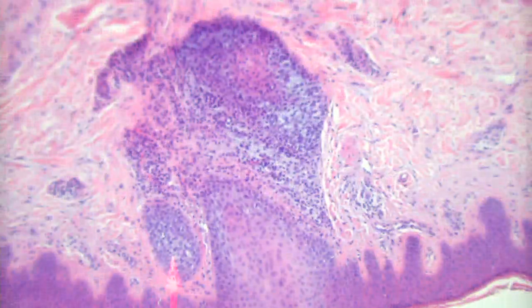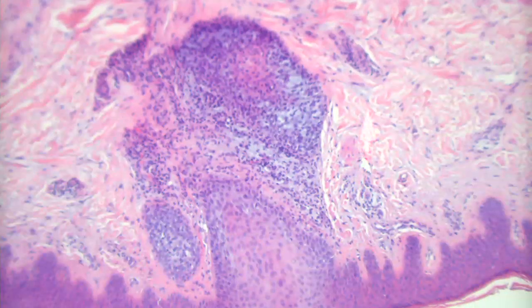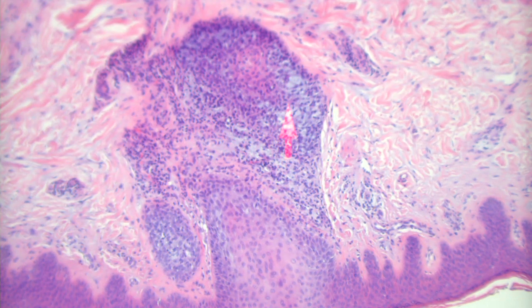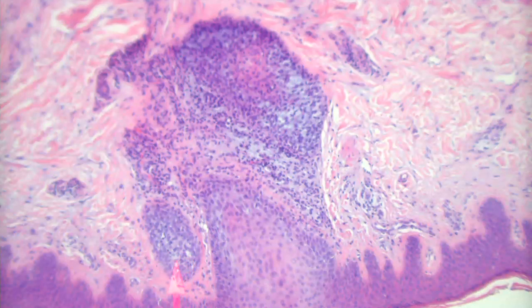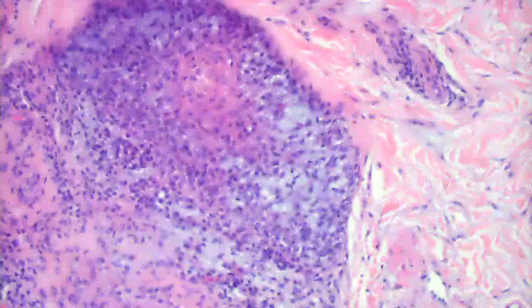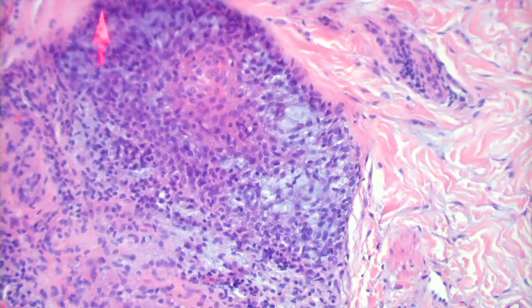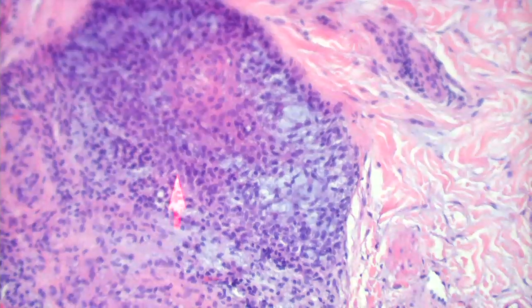You said mucin. There's a little bit here. I'll agree with that. But what about this? Yeah, that's not mucin. No? Well, it could be. Where is it? It's within the epidermis, or is that surrounding? What is this structure here? I think probably a hair follicle.